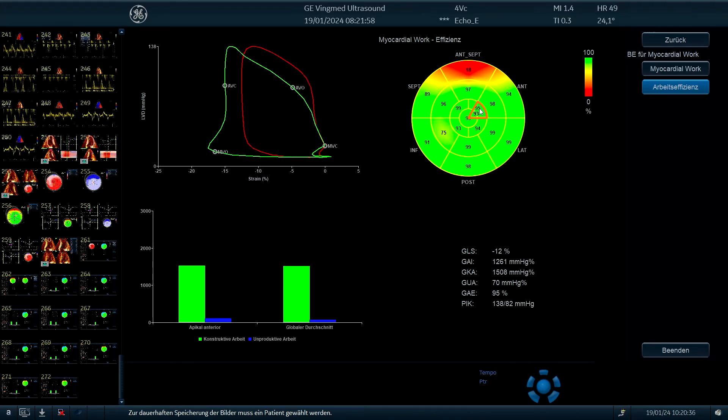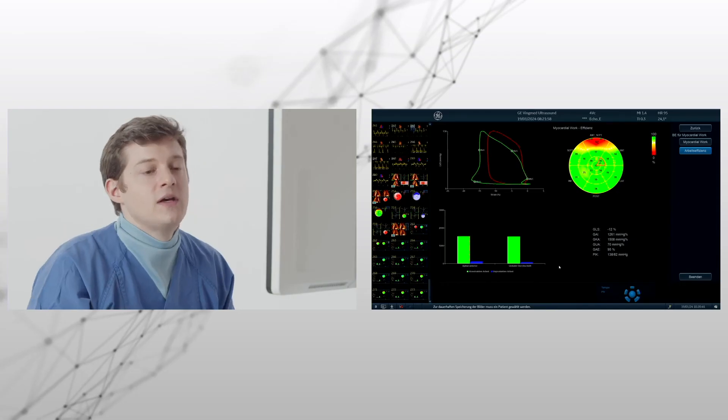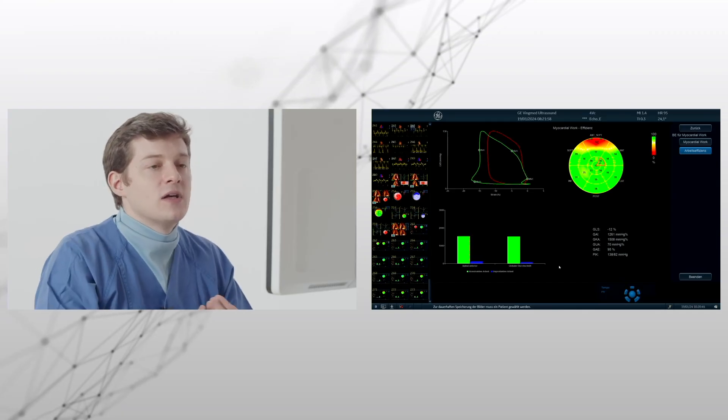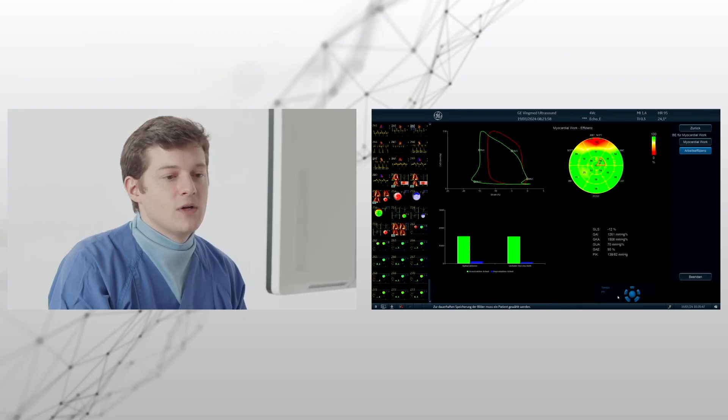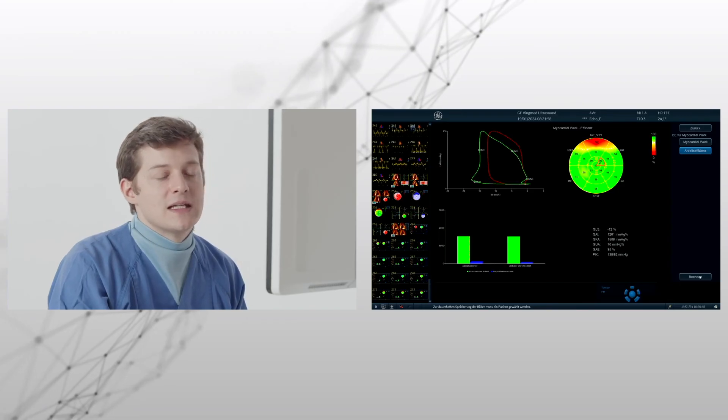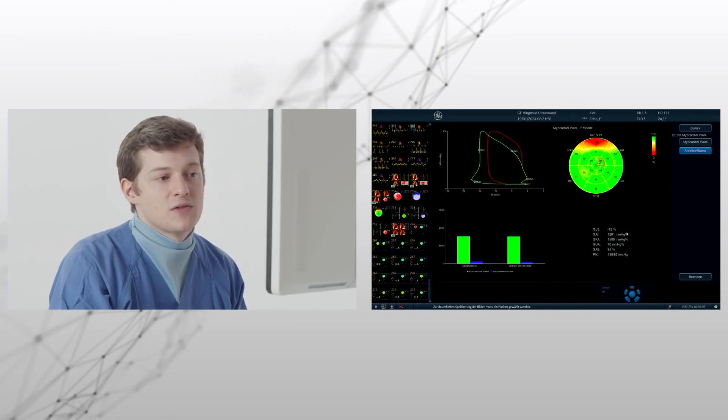So they are doing all the same in the same time interval. Here you see green is good, blue is not good. So a lot of green means good, and 95% is actually a normal measurement we also would see in young healthy individuals.